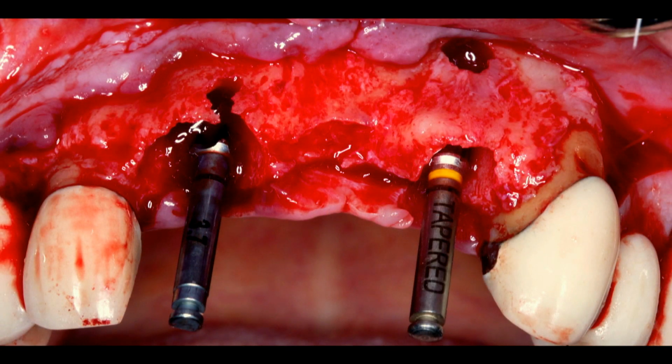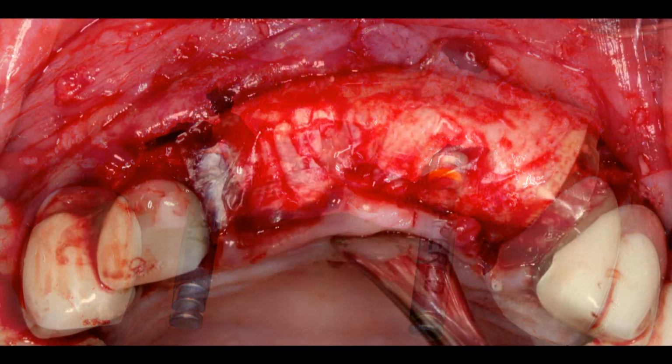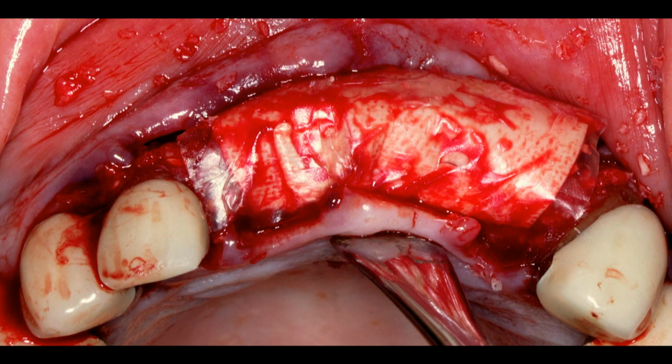Yeah, and as John mentioned, sometimes we don't need stabilizing sutures. We don't even need screws or tacks because maybe we have a defect to graft into. I find for these defects, maybe when they're more outside of the housing, it is beneficial to have some stabilizing sutures. So in this case, I actually planned on using a collagen membrane, and I showed you the pre-op to this case earlier, but sometimes we don't account for that extra bulge of bone graft that we want to place, and I tend to overgraft, especially in the maxillary anterior.